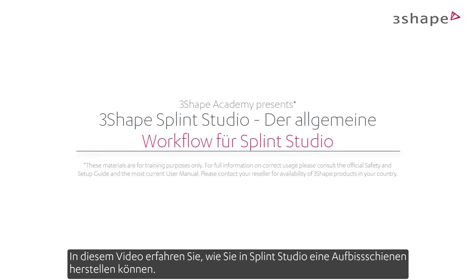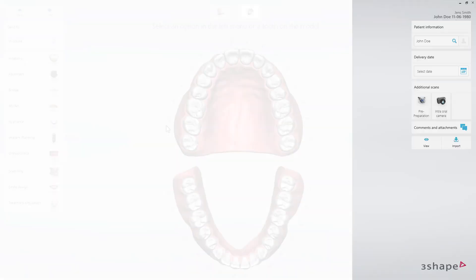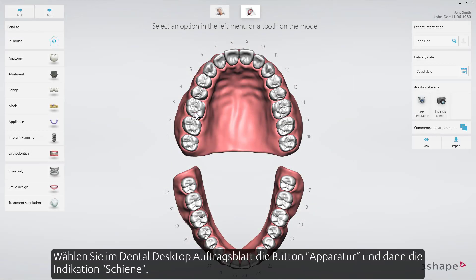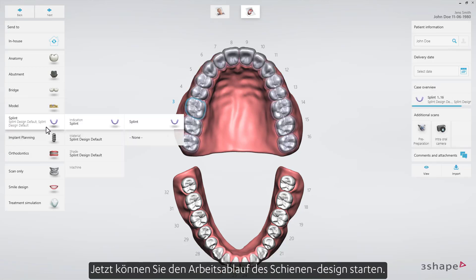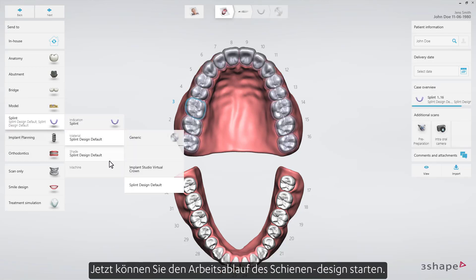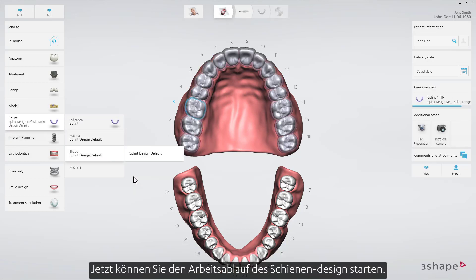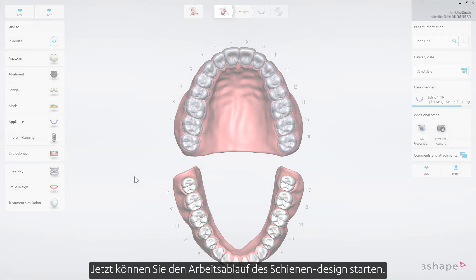In this video you will learn how to use the tools in Splint Studio to make occlusal splints. When in the dental desktop order form, select the appliance category and then splint. Now you'll be able to start the guided splint workflow.